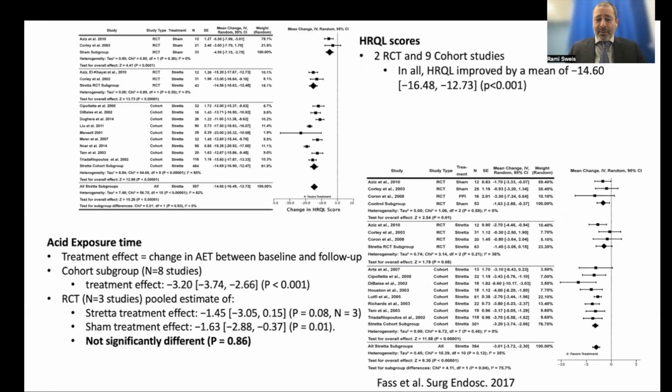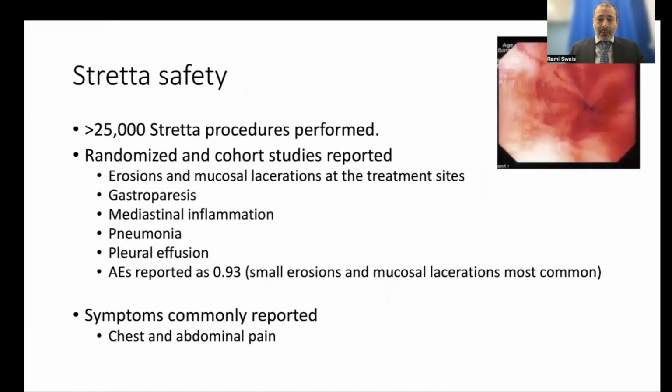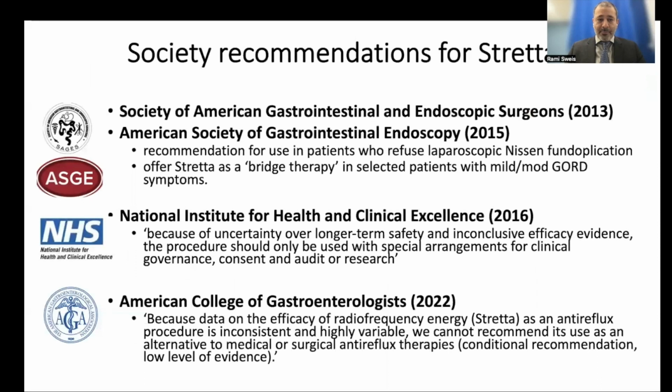Here is one of the biggest meta-analyses that was published in 2017. If you can see here, from 2 randomized controlled trials and 9 cohort studies, there is a significant improvement in health-related quality of life questionnaires. When looking at acid exposure time, in fact, the randomized controlled trials show that there's no significant difference between sham or Stretta when looking at ambulatory pH monitoring results. Stretta is safe. It does not contribute to major adverse events. The side effects that can occur are temporary and usually modest. So there is no real concern about safety with regards to Stretta.